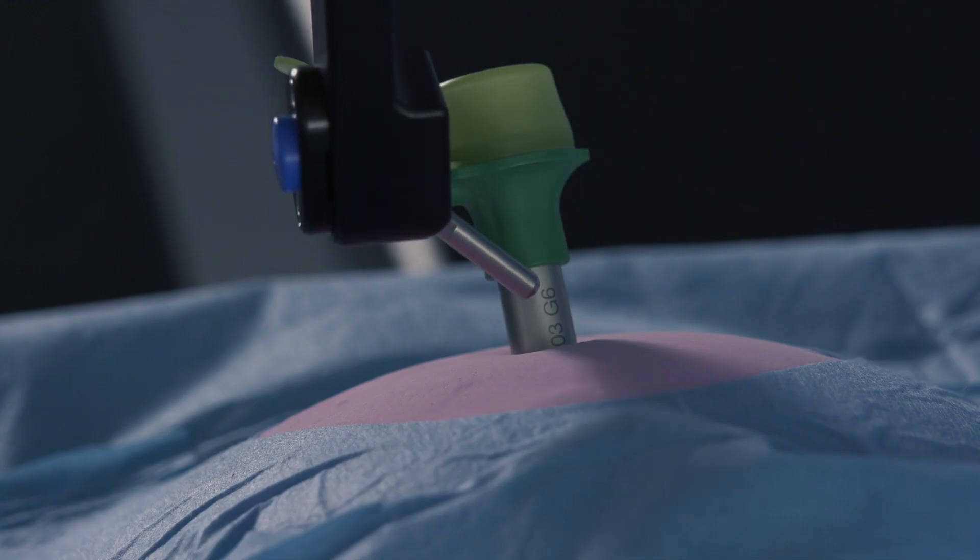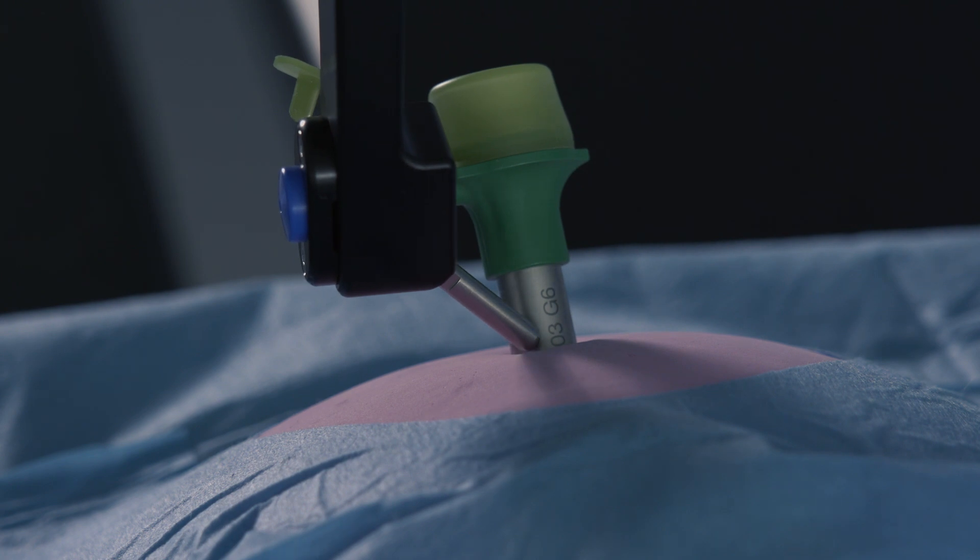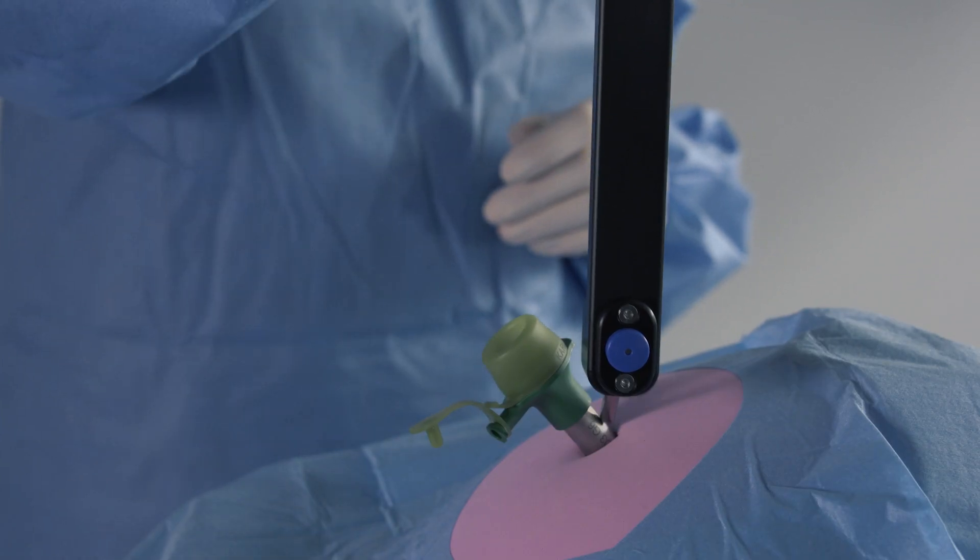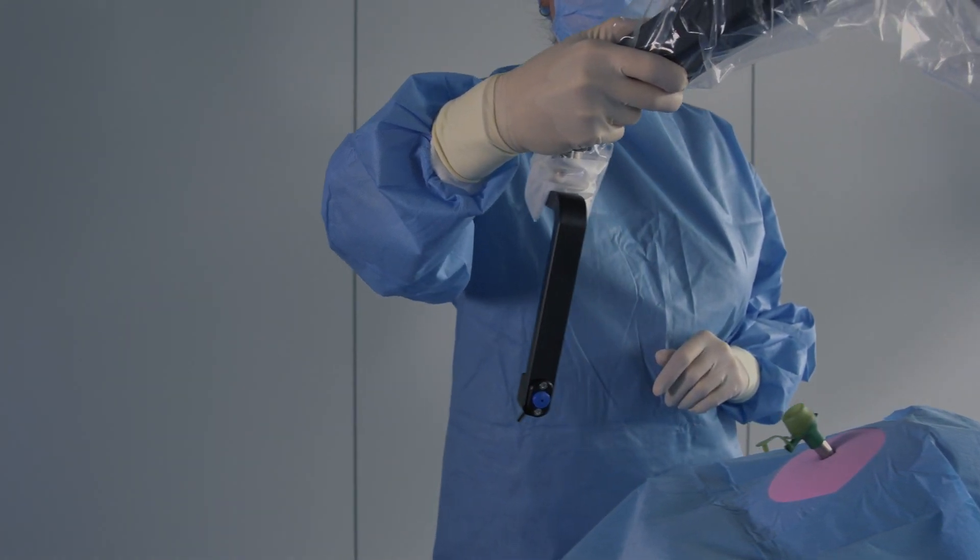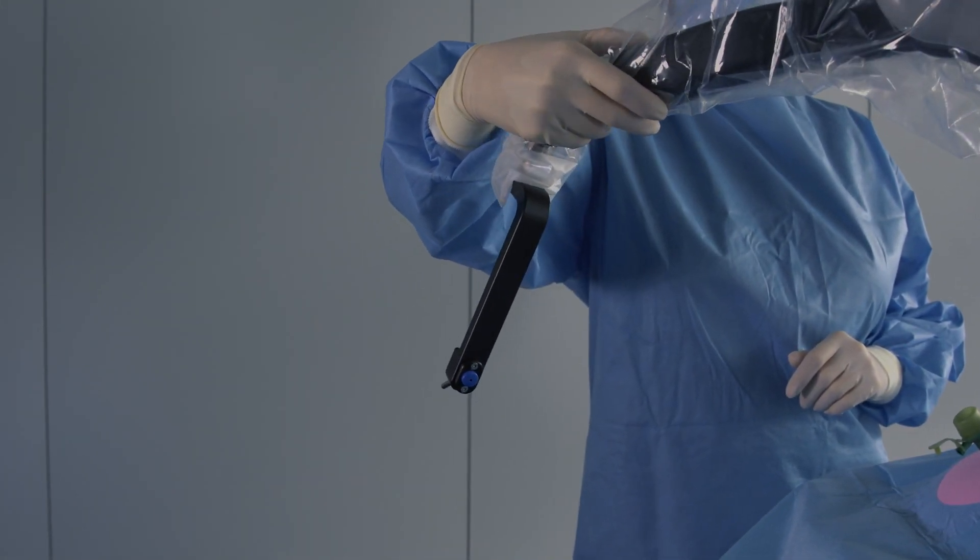If you lose power during the case, you will need to reset the trocar point. After setting the trocar point, move the arm away by pressing the unlock button on the control panel.